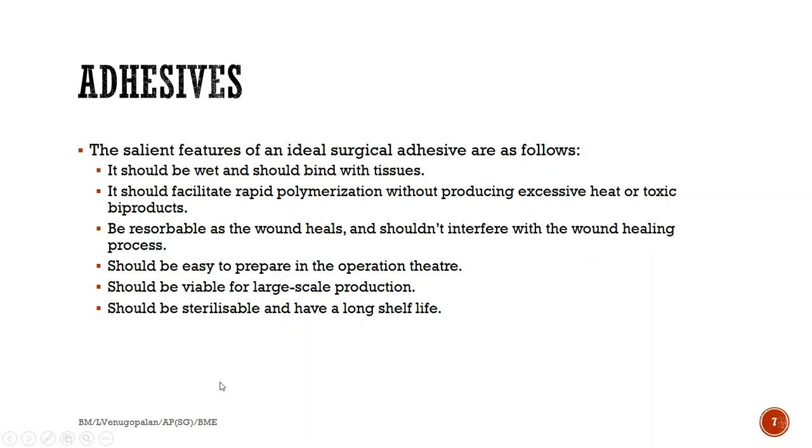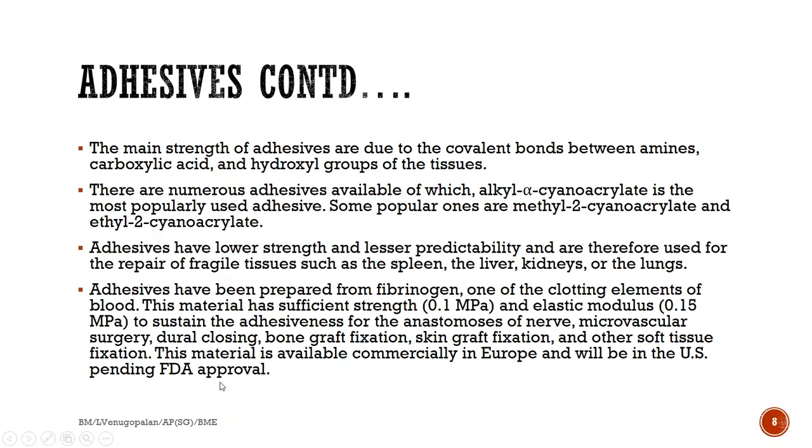It should be viable in large scale production, for commercial reasons. And it should be sterilizable and have a long shelf life. You do not want to induce infection due to the use of adhesives. So it should be sterilizable and it should have a long shelf life, right?